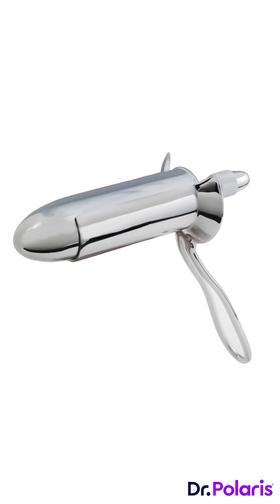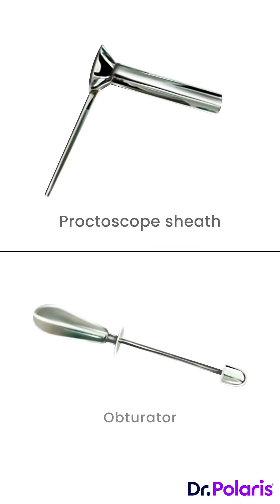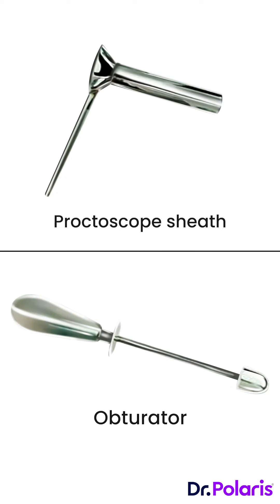What is the instrument that you see here? If you said that it's a proctoscope, then you're perfectly right. A proctoscope has two parts: an outer sheath and an inner obturator.